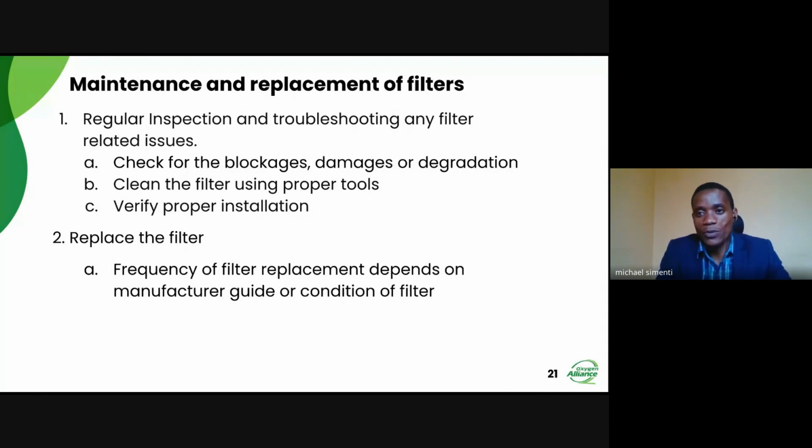That's most important. As an institution or organization, you need to schedule a time: in a week, how many times do we need to go to the wards and assess the status of the filters? In a month, how many times do we need to go clean or assess our filters? We need to schedule that. So if there are issues, when you are inspecting, you'll be able to troubleshoot them. Therefore, you rectify those problems before they lead to stoppage of usage of that particular device, which is most important as far as the life of the patient is concerned.